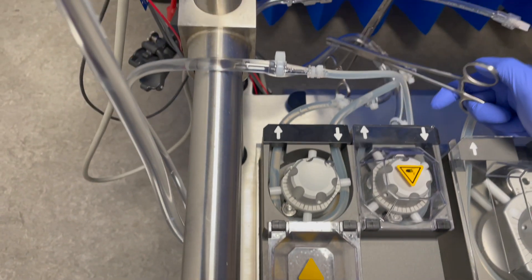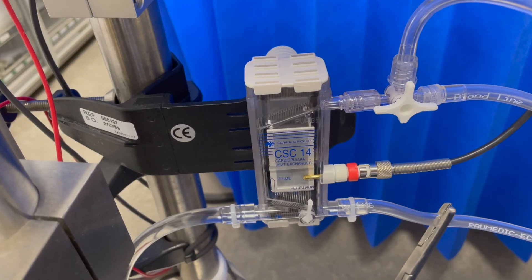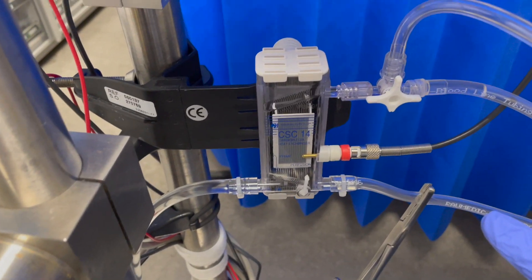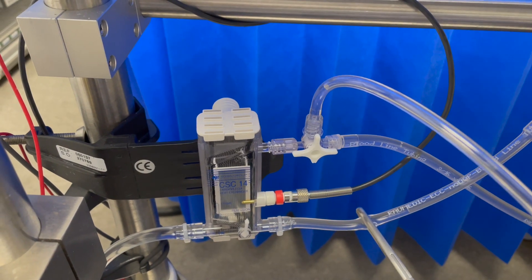Continue priming the plegia set with a very low flow. Fill the plegia set gently. When the fluid reaches the top, increase the blood pump flow. Quickly release the plegia outlet clamp to fill the outlet line.